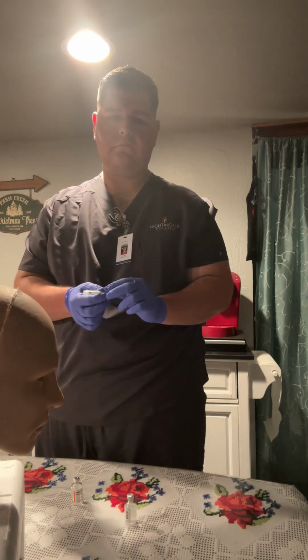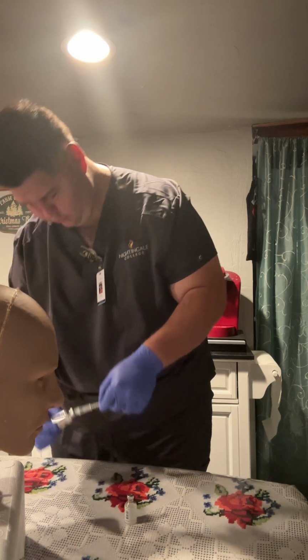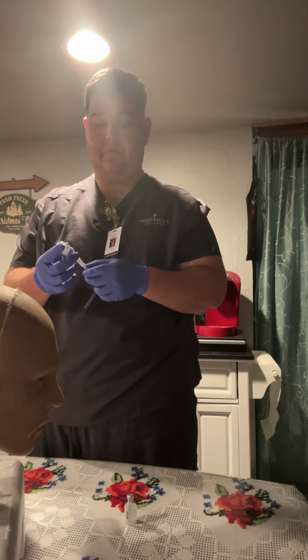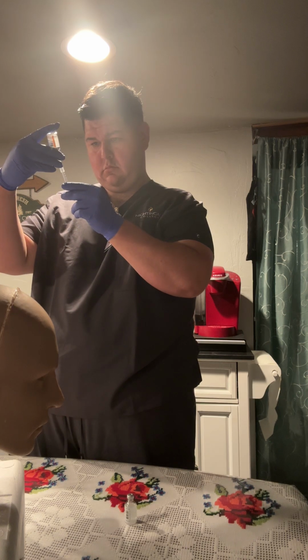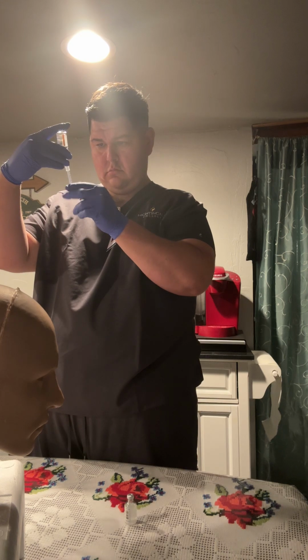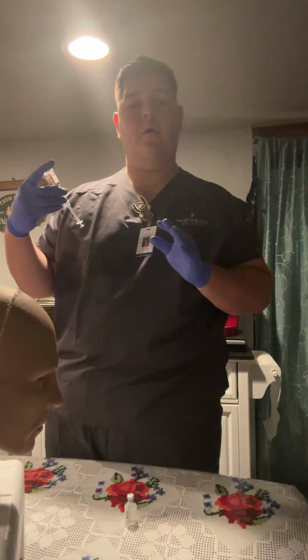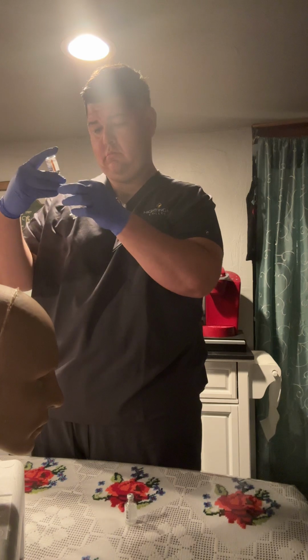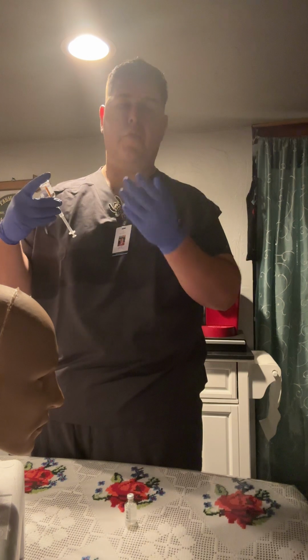Okay. At this point, I will pick up the vial, invert it, and draw 4 units of insulin. I can tap to remove any air bubbles. If I need to, I can push all the insulin back all the way into the vial and then redraw as well.